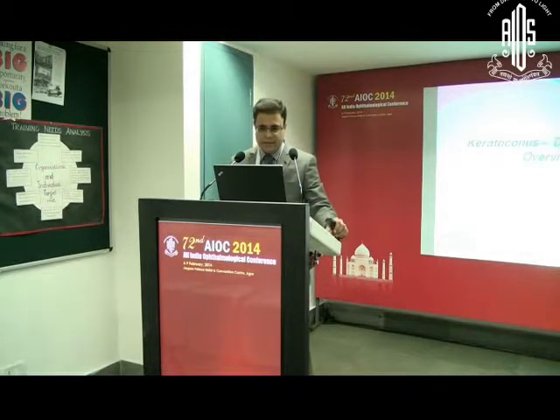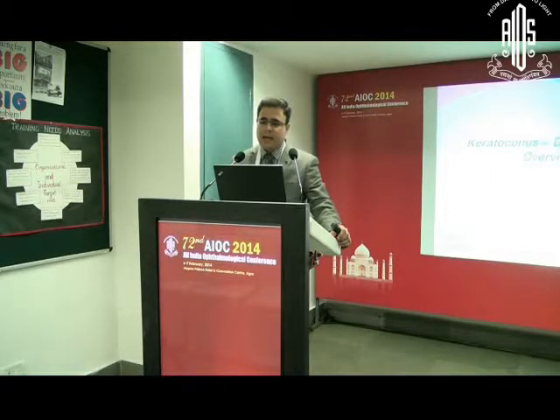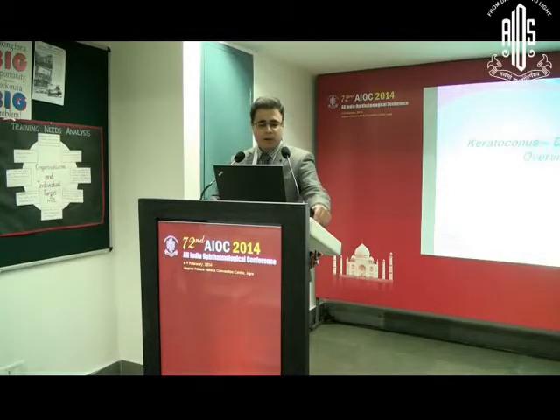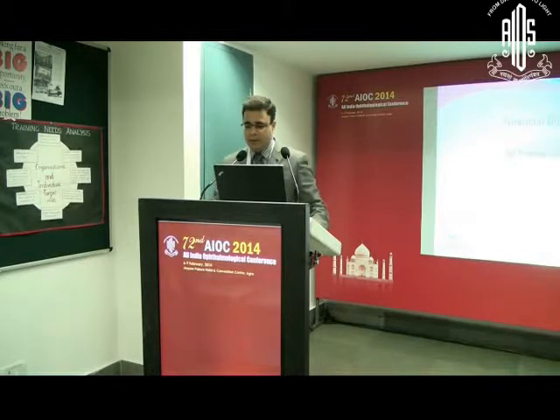What I'm going to do is talk about keratoconus, the basic diagnostics, and a little of the overview. I'm not going to go into any too crowded slides, but it's more of a case-based presentation whereby I'll be showing you some maps, and things will be pretty clear with this case-based approach. I have no financial disclosures to make in any matter that I am presenting.